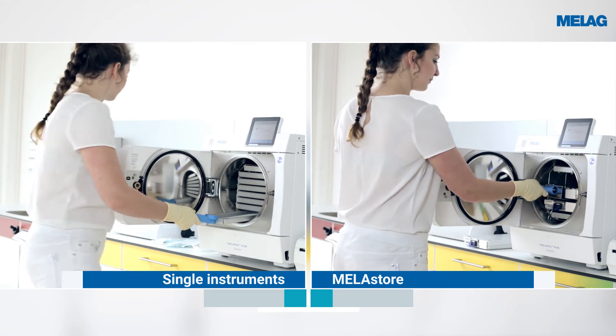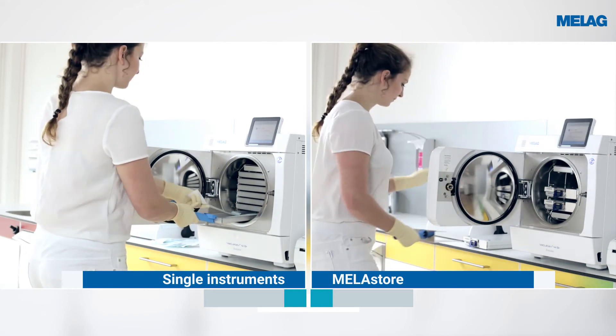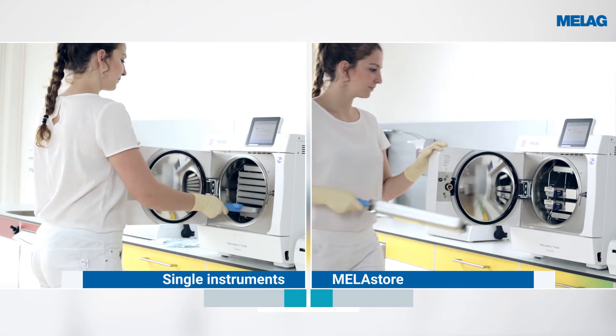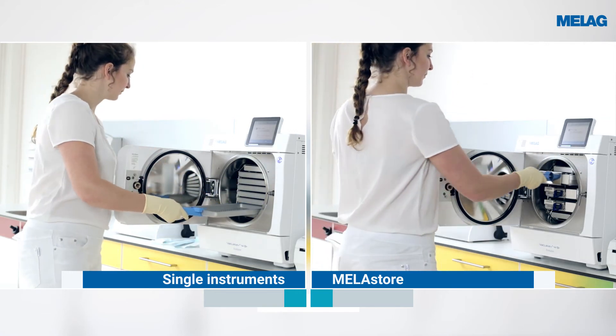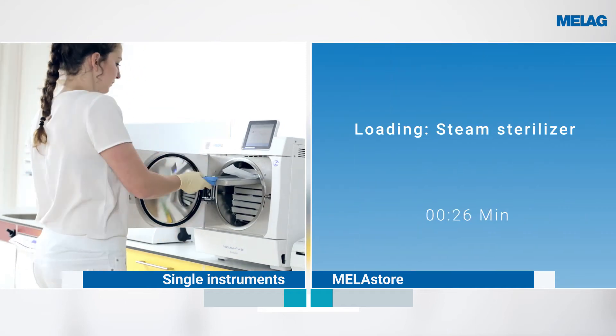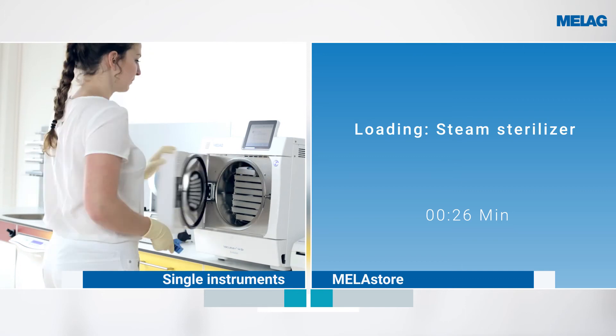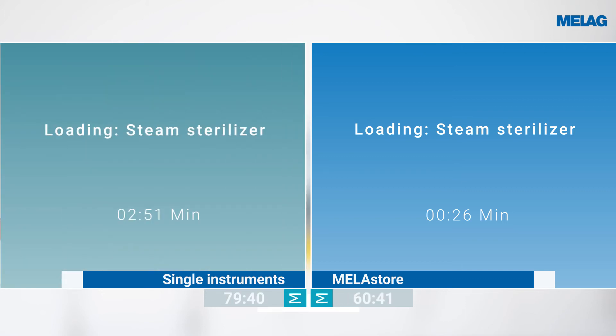The MELAstore system saves considerable time during the loading of the steam steriliser. The time saved treating the identical quantity of instruments with the MELAstore system amounts to around two and a half minutes.